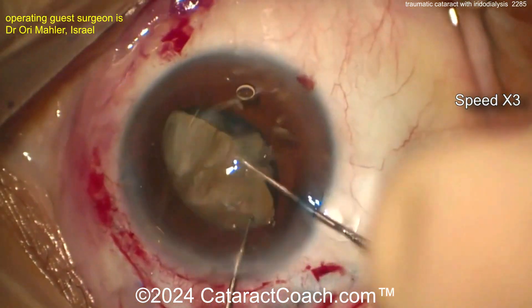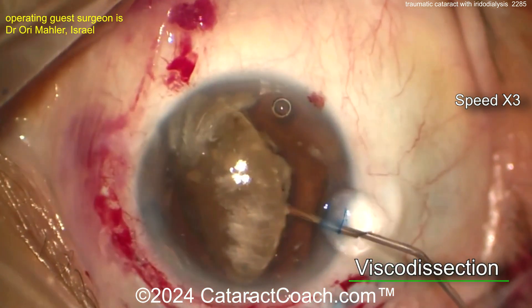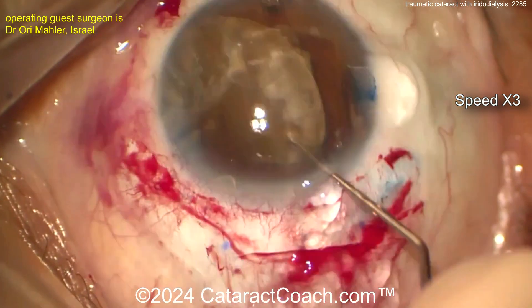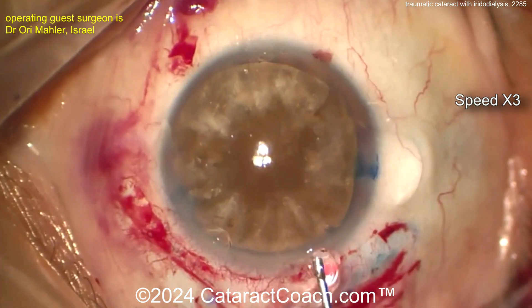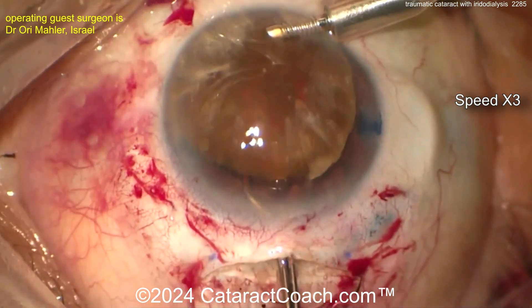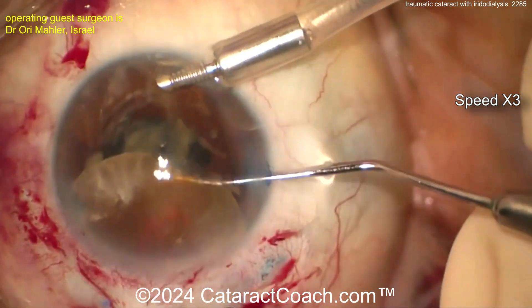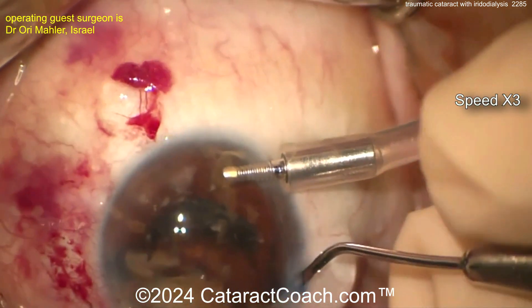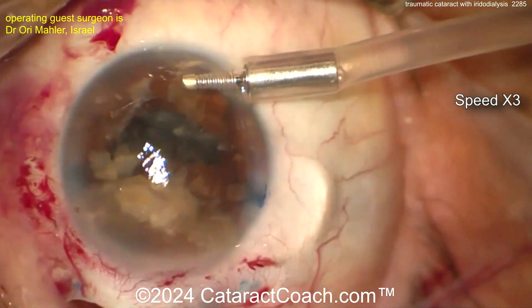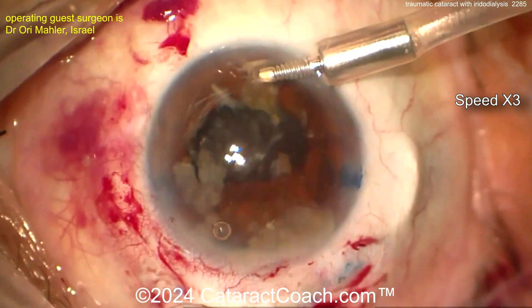Now going in there, lifting that nucleus up. Let's get this thing out of the bag — look at that two-handed technique. A little more viscodissection to protect that posterior bag. There's the whole nucleus. You didn't know you were going to get to see an MSICS procedure! There's the AC maintainer going down — that's going to help keep it pressurized — and then get that nucleus out of the eye. I like that second-hand technique. Deliver that baby.